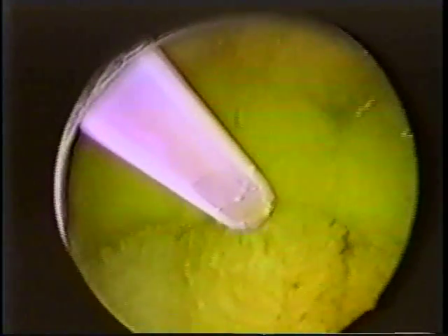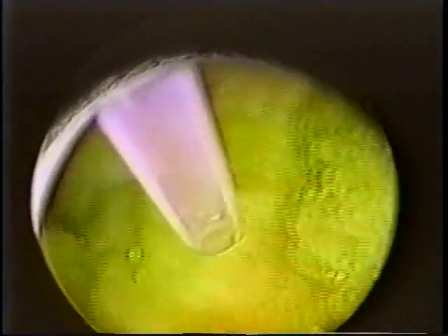On turning the resectoscope with a 30-degree lens upside down, it is possible to see a large number of tumors located within a diverticulum on the anterior wall of the bladder immediately adjacent to the air bubble. These tumors would be extremely difficult to resect with standard electrocautery, and it would be very dangerous to attempt to do so when they are located in a bladder diverticulum in that area.